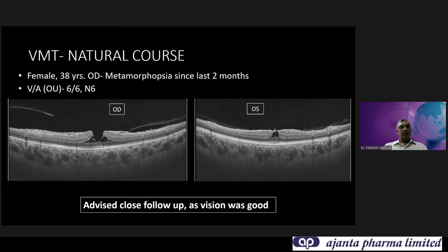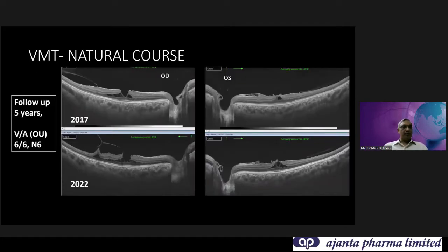But now look at this case, a 38-year-old female who reported with metamorphopsia since 2 months. Vision was 6/6 and N6, but in both eyes you have a vitreomacular traction, the splitting is there, and cystic spaces are there. But vision was good, so we decided on very close follow-up. Over the subsequent 5 years, vision is maintained at 6/6 and N6. There is no posterior hyaloid separation. There is subtle worsening of the OCT images, but over 5 years, because vision is maintained, this type of patient can be safely observed.